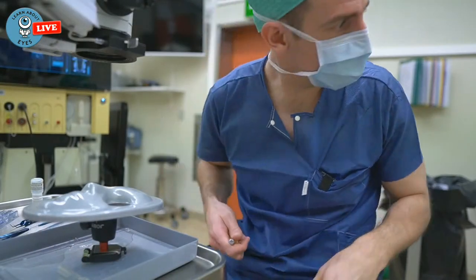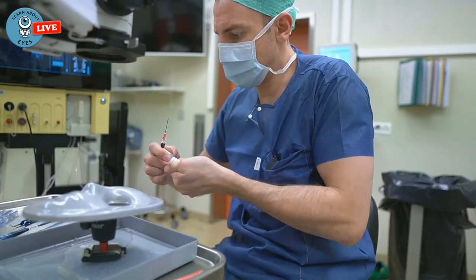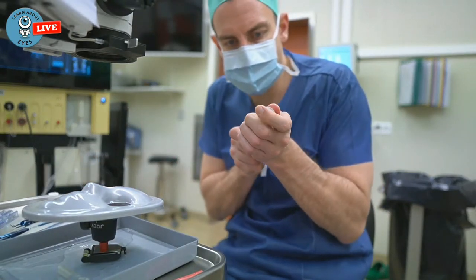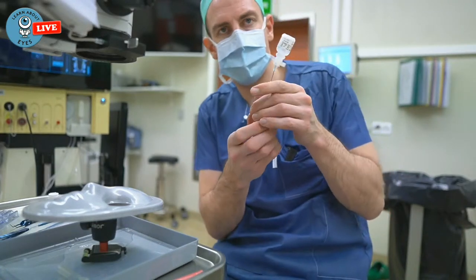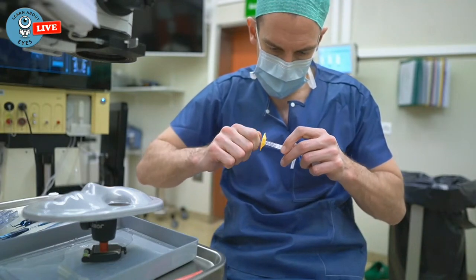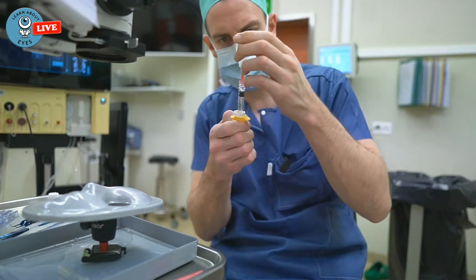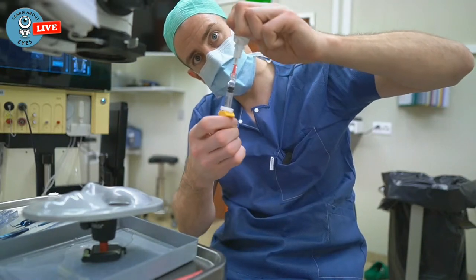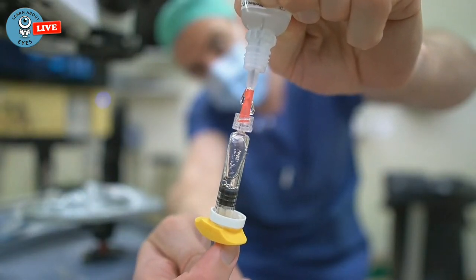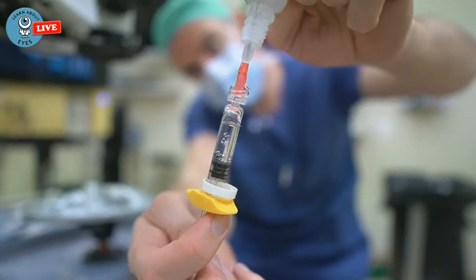All right, so as a last thing, that's the thing that I showed you. Use these, here's a big cannula. Use one of these cheap things right here. And just, oh no, you can't use that one, can you? Yes, you can. That's a cheap way to get Visco.